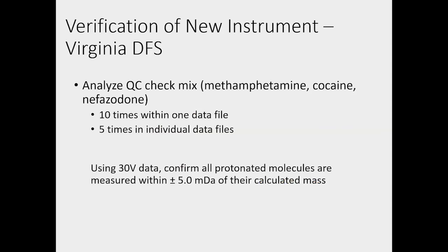Okay, so I talked about how we at DFS validated the method as a whole, but that was run on our instrument in the central laboratory. So once our regional laboratories got their own instruments, we basically performed an addendum to that validation where we verified that each instrument is still working appropriately and within the scope of that initial validation. And this verification process is actually listed in our operating procedures, which are available on our website publicly. So if anyone is interested, they can feel free to check that out. But basically, whenever we get a new DART instrument and after it's installed and the manufacturer is happy that it meets all of their required checks, we perform our own verification.